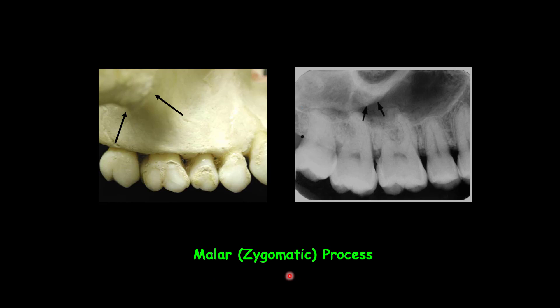The malar process, or zygomatic process, is a projection of the maxillary bone that extends on the buccal surface and articulates with the maxillary process of the zygoma. On practical radiographs, it can be seen in the region of the first and second molars as a U-shaped radiopaque line with its opening upward. You can see the sinus floor and inferior border of the zygomatic process, along with an extension posterior from the zygomatic process called the inferior border of the zygoma, visible as a uniform radiopacity over the apex of the molars.